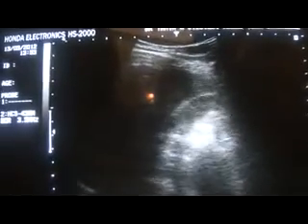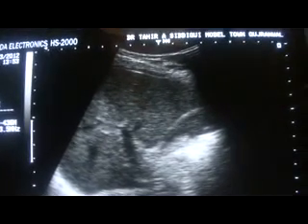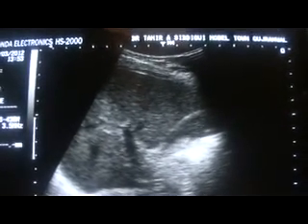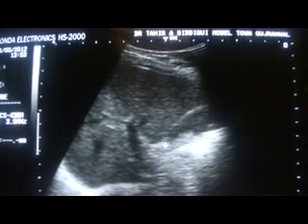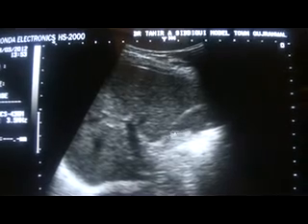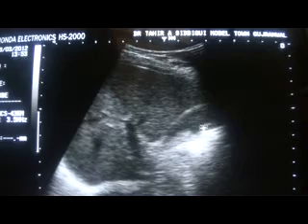This is the layered-out sludge with the posterior wall of the gallbladder, and this is mobile sludge. Moreover, what we see in this gallbladder is not only sludge — there are multiple suspended calculi of variable size. The largest measures approximately 5.2 millimeters and gives a posterior shadow. There are multiple calculi suspended in the sludge, and they are all giving posterior shadowing as well.